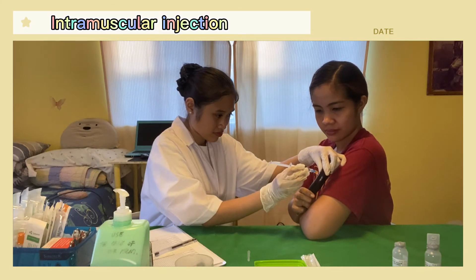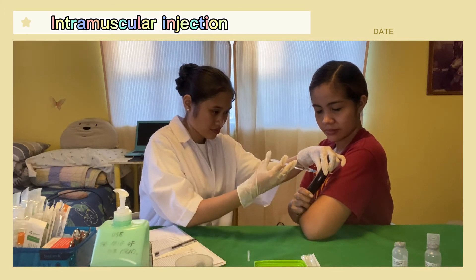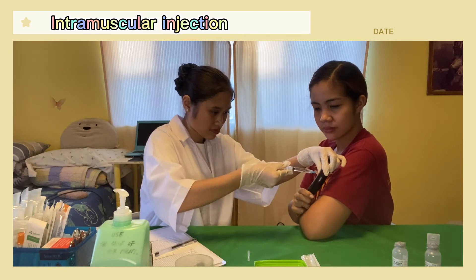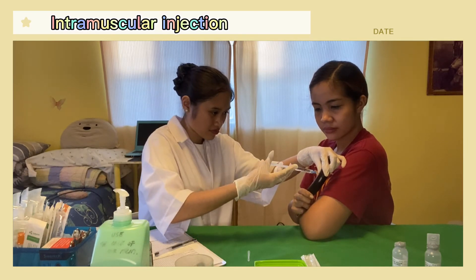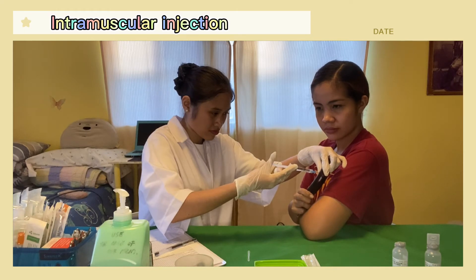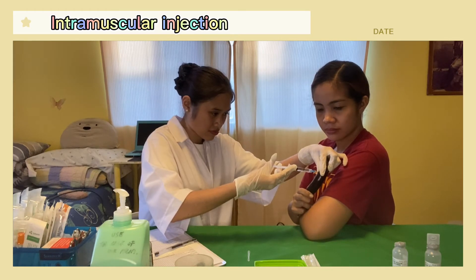Inject the needle quickly and firmly at a 90 degree angle. Grasp the lower end of the syringe with the non-dominant hand and position the dominant hand to the edge of the plunger; do not remove the syringe. Pull back on the plunger to ascertain if the needle is in a vein. If no blood appears, slowly inject the medication.